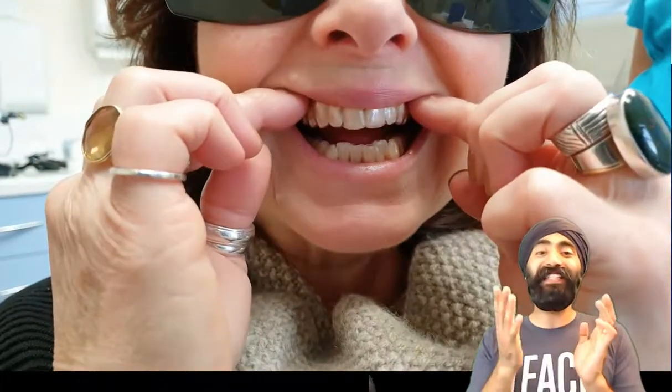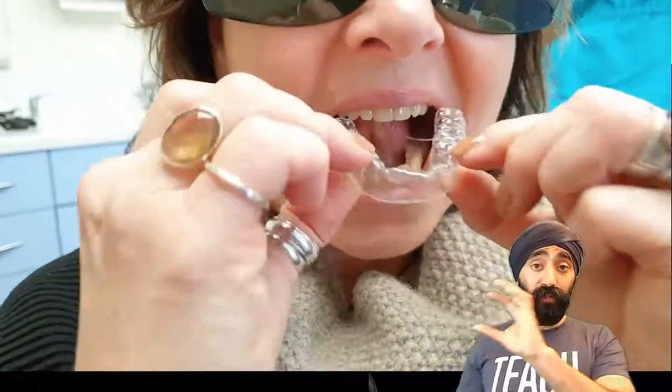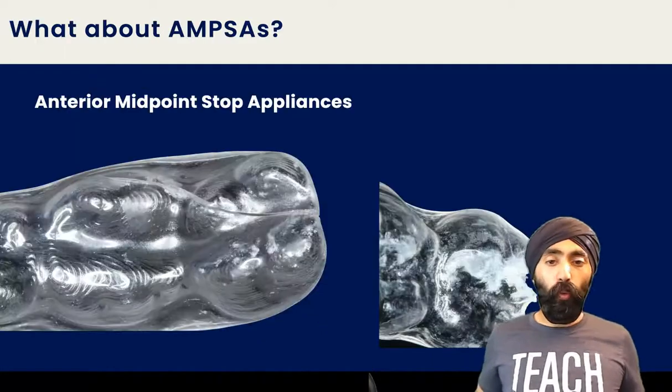If you design these to be passive fitting, okay? Because what you don't want to do is give someone who's not had orthodontics a tight Essex retainer. They will not wear it, they'll hate you, okay? If you design it very generously blocked out with the undercuts, then it should just slip on and off very easily. That is what we call a passive fitting retainer. So this passive fitting retainer could be the answer, right? Because it's hard, they will hopefully not wear through it as quick as they did the soft bite guard. It should be much easier to wear because there's less occlusal vertical dimension opening compared to, let's say, a Michigan splint. And then you might get some wear facets over time, and this splint is 4 years old, and that's fine, that's good. But what if you start getting this?